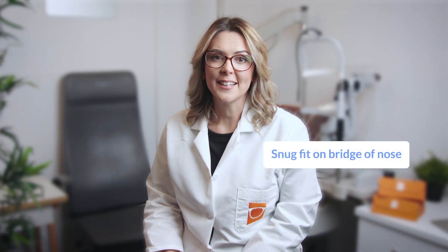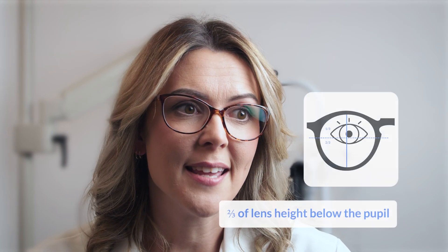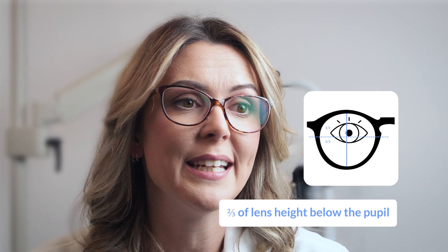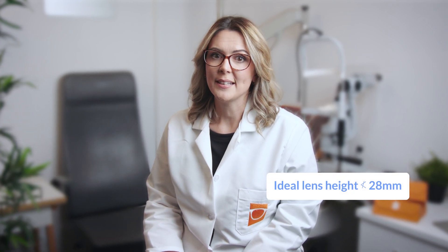Progressives work well when they sit snugly on the bridge of your nose and close to your eyes. You want a deep lens area with around two-thirds of the depth or lens height below the pupil to ensure you get a full reading area. The ideal lens height is no less than 28 millimeters.